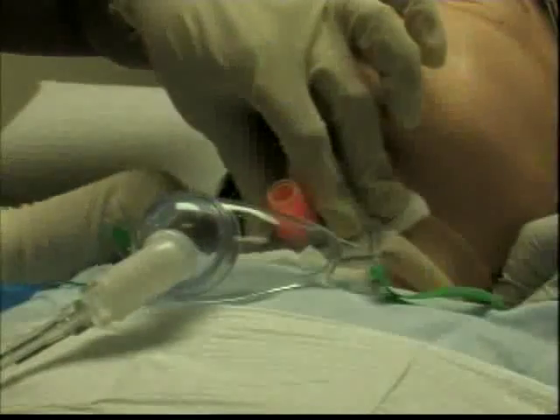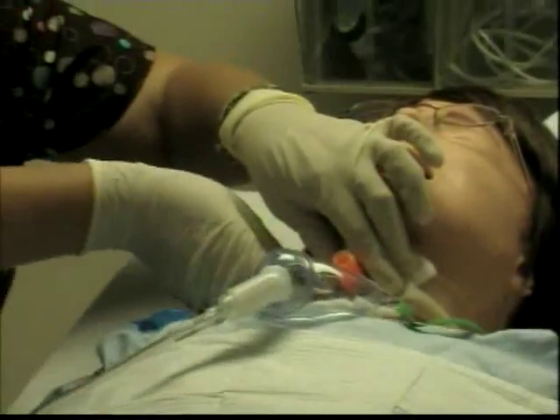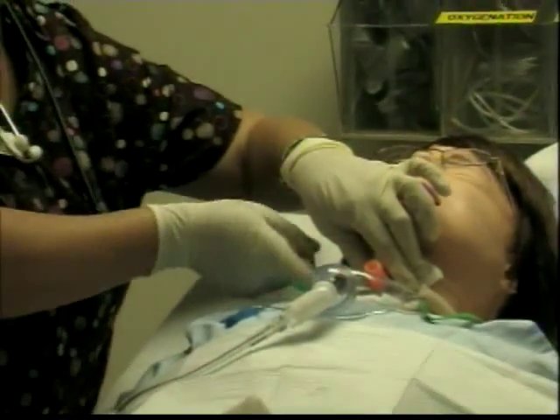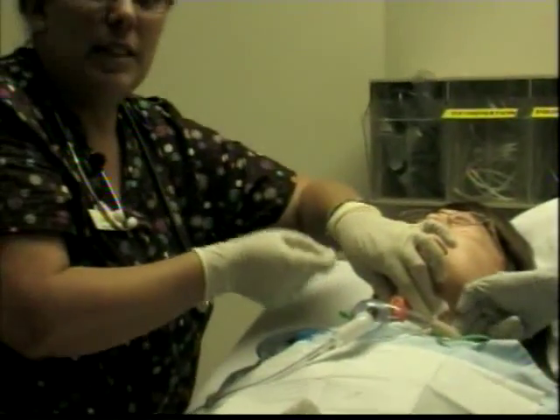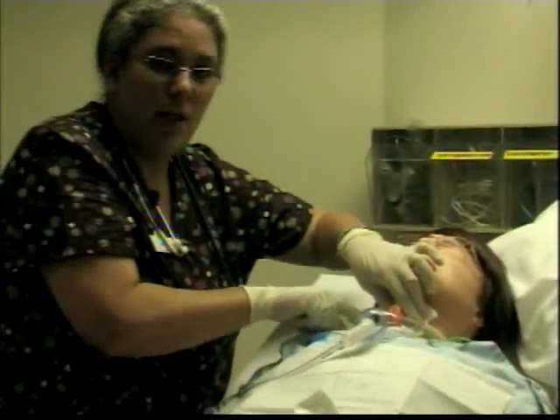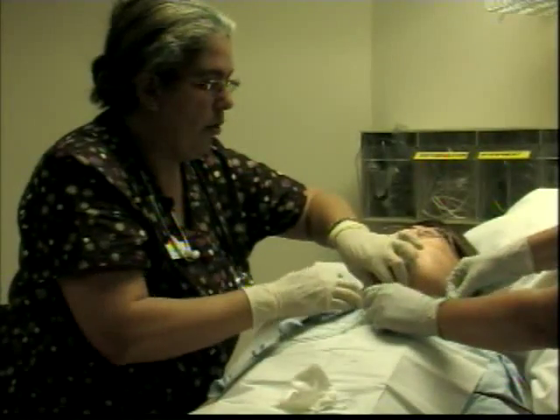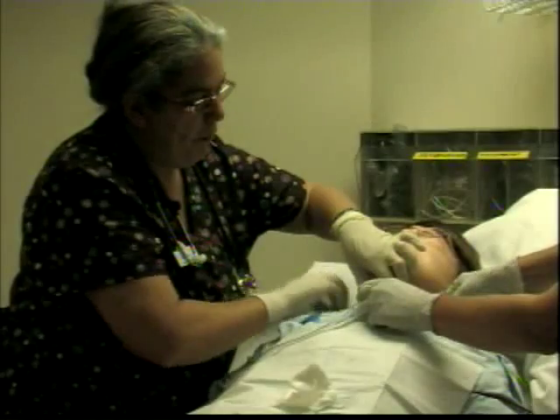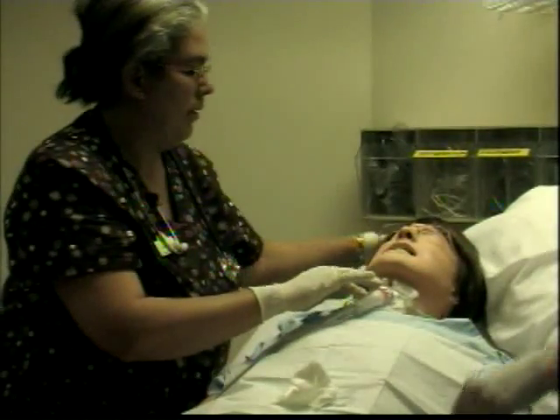Now, the main thing that you want to remember when it comes to the straps is that you can do 2 snug fingers underneath or 1 loose one. You don't want it too loose, you don't want it too tight. Remember, even though it has some cushion in it, you want to make sure that you have some room in there for the patient to be comfortable. You want to make sure that you replace the oxygen source and the patient is comfortable.